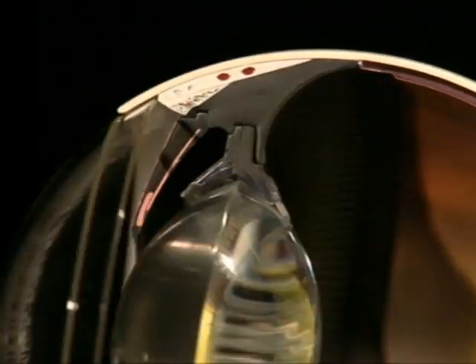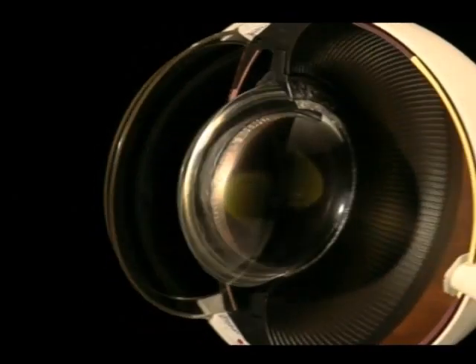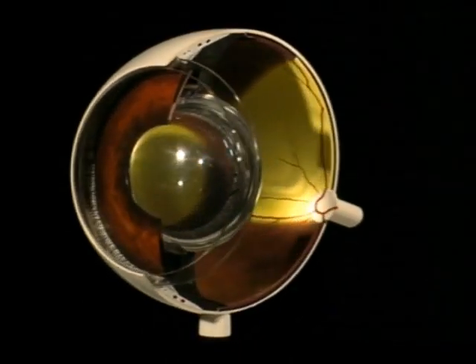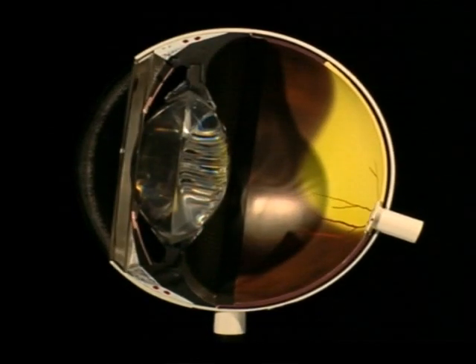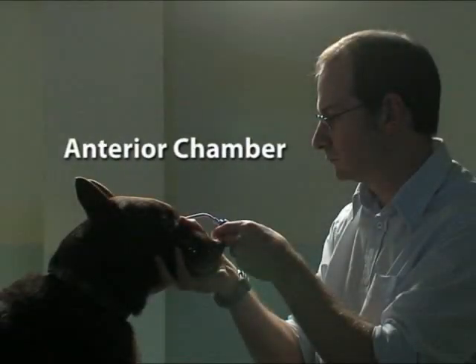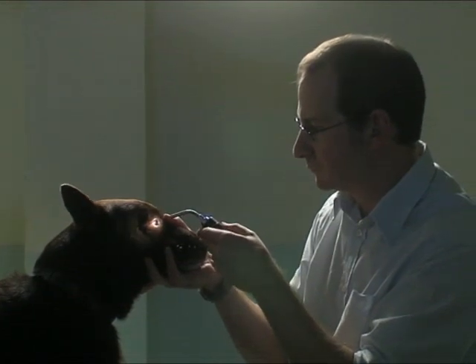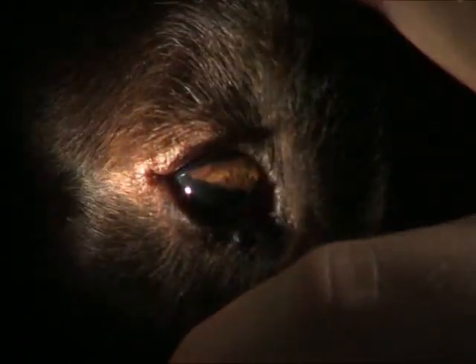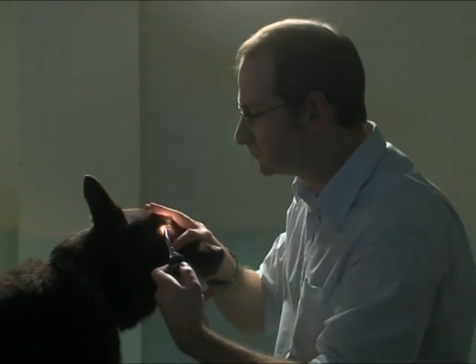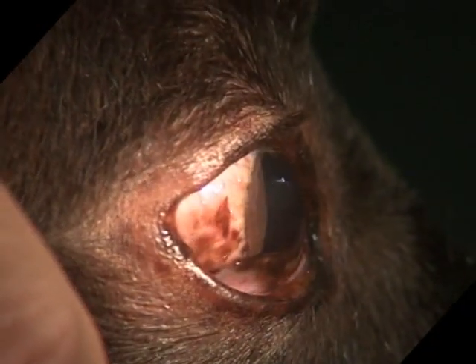The delicate balance that exists within the eye can be disrupted by a number of disease processes. The resulting clinical presentation reflects the impact of disease on the intraocular environment. For thorough inspection of the anterior chamber, the eye needs to be illuminated from different directions and the chamber viewed from different angles. Looking from the side allows assessment of chamber depth.